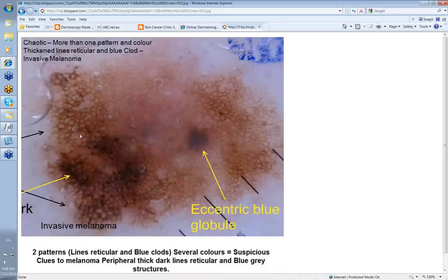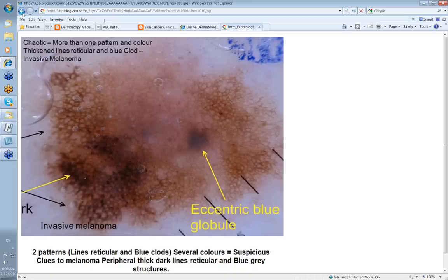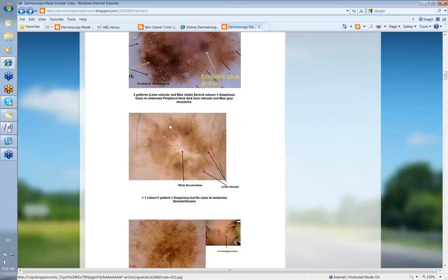Let's look at this case — same patient actually. More than one pattern and color. Here you have thickened lines reticular, darker color, peripheral. There's also an eccentric blue globular clod and some blue-gray structures. So two patterns — lines reticular and blue clods — and several colors, making it suspicious. The clues to melanoma were the peripheral thick dark lines reticular and the blue-gray structures. This was in fact an invasive melanoma. You can see it's not all that different from the previous one, which was reported as a severely dysplastic nevus — either way, the severely dysplastic nevus was excised with 5 mm margins.